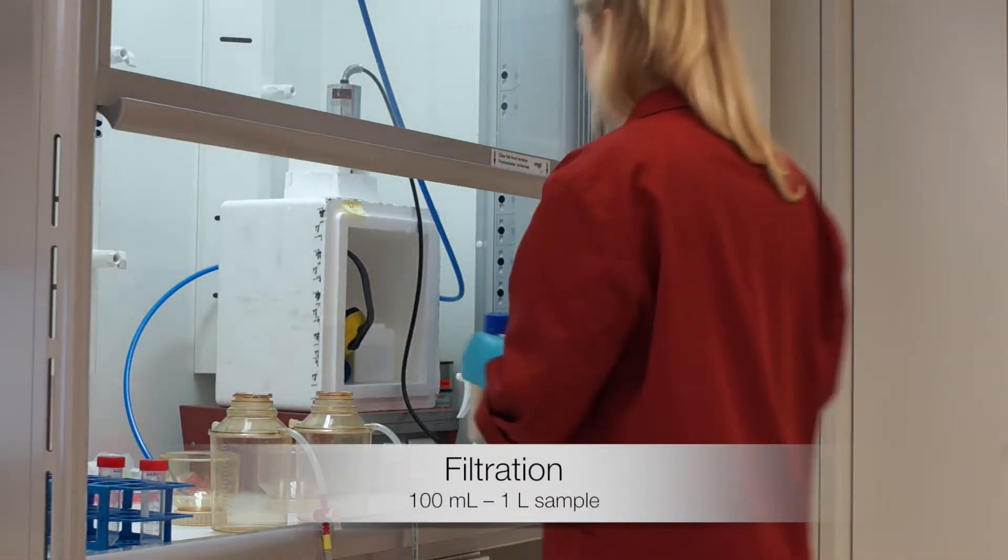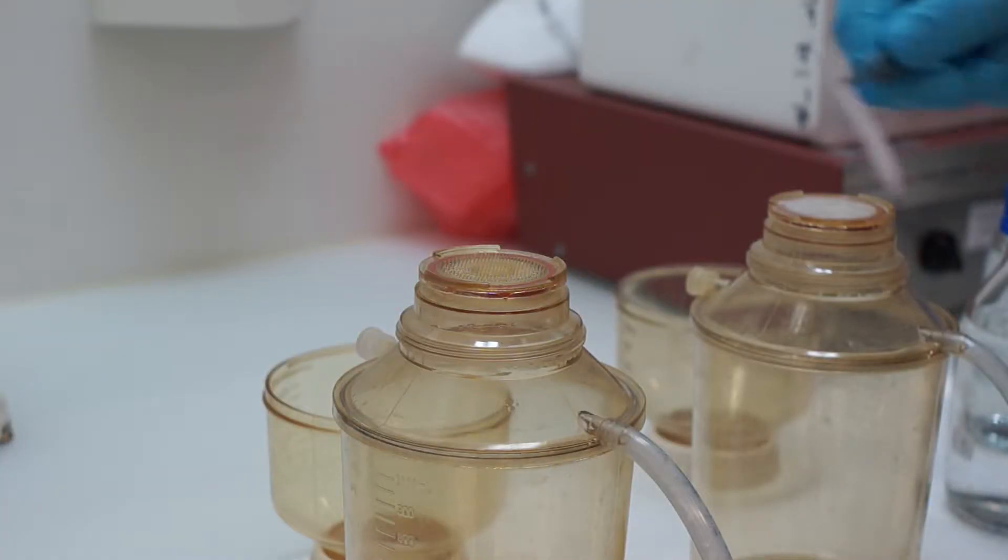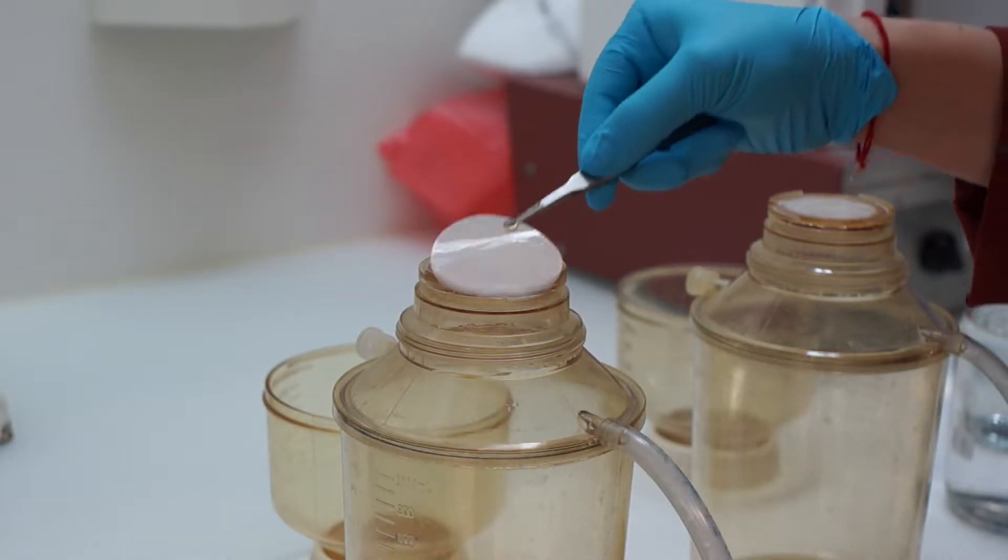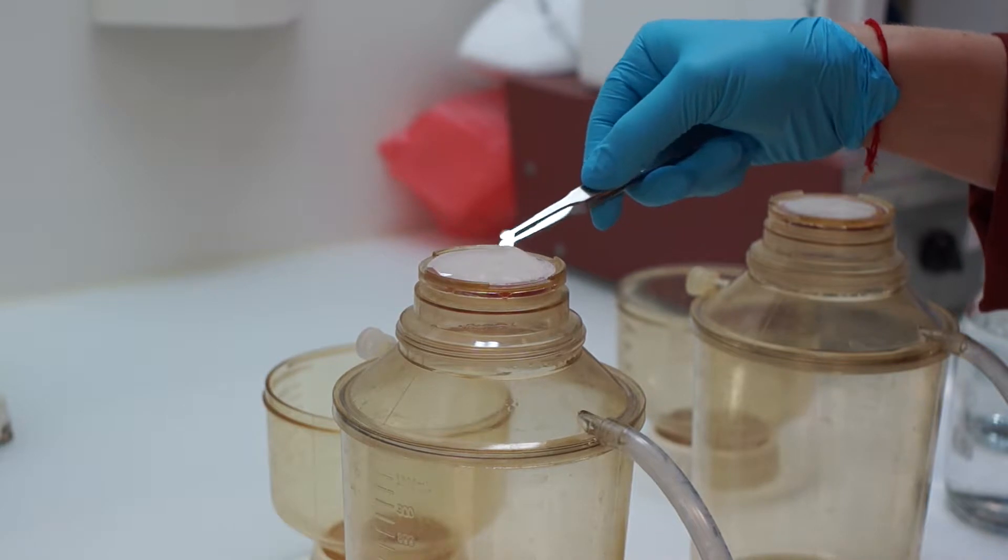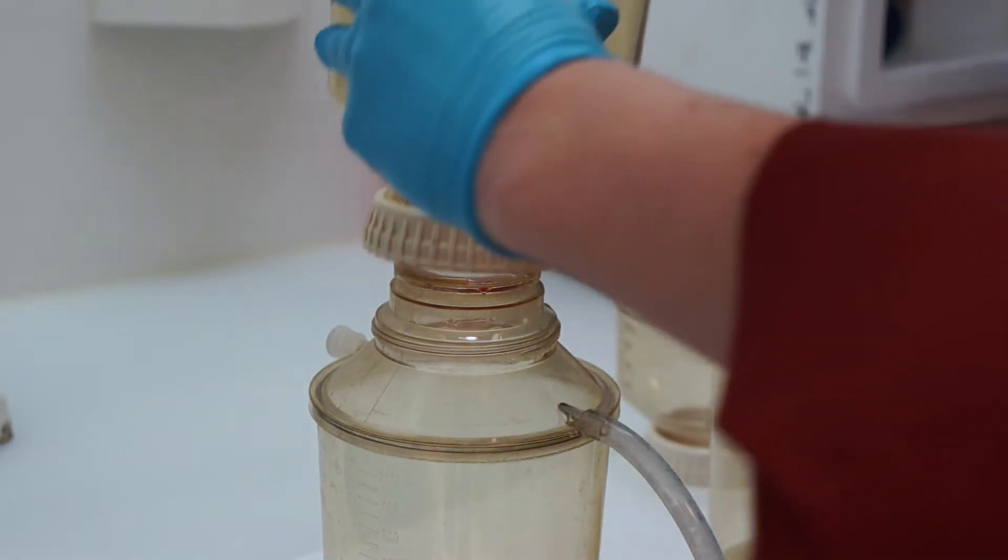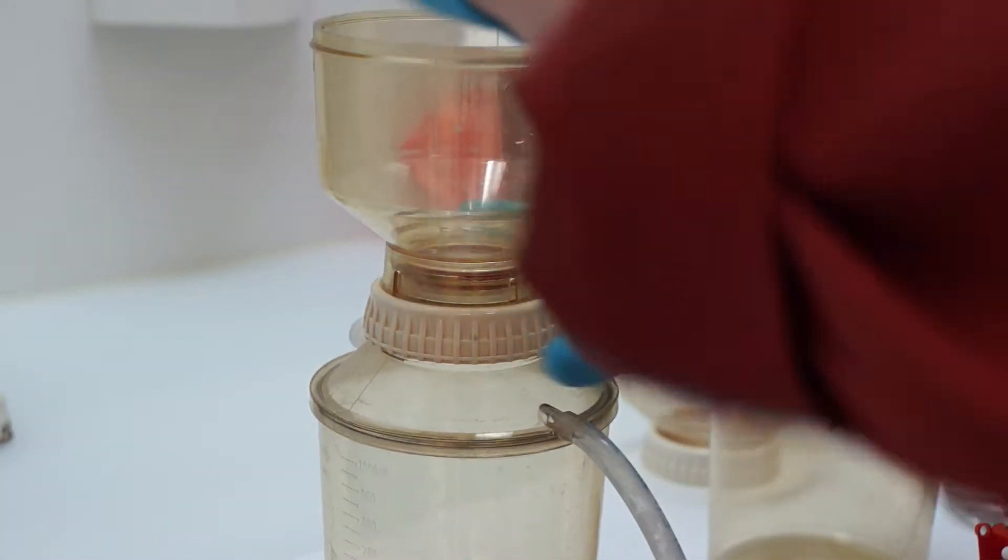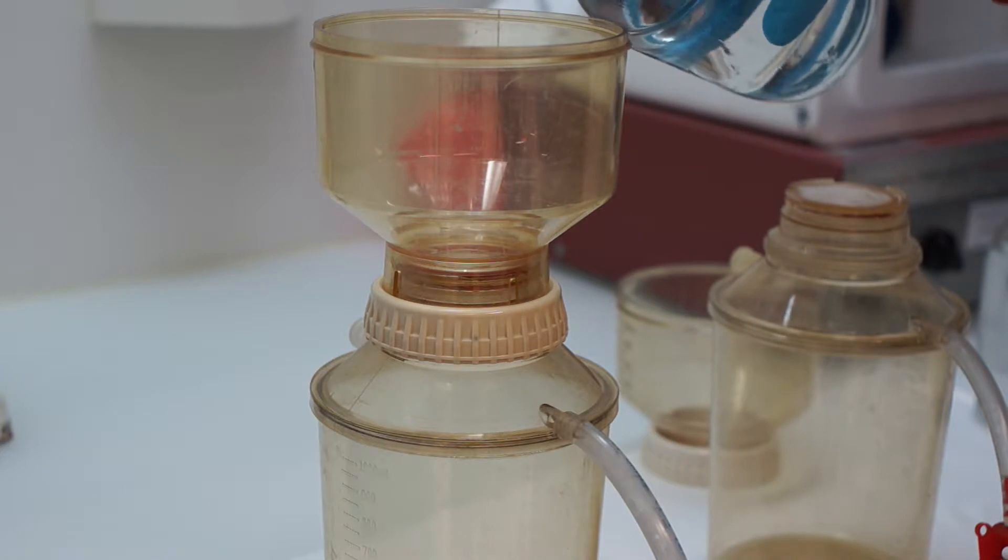Then I'm going to filter the water samples with a standard filtration unit. I'm placing the filter that RQ Macro provides with the kit on top of the filtration unit with the shiny side facing upwards. Then I'm attaching the upper part of the filtration unit, switch on the pump and let the sample run through the filter.